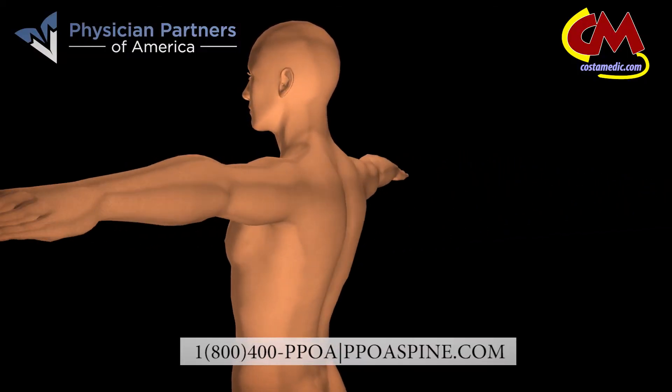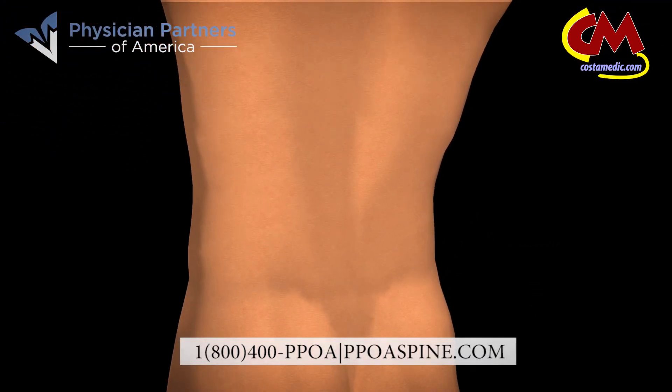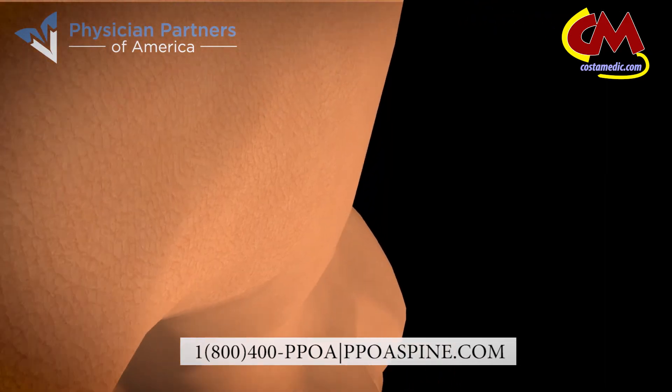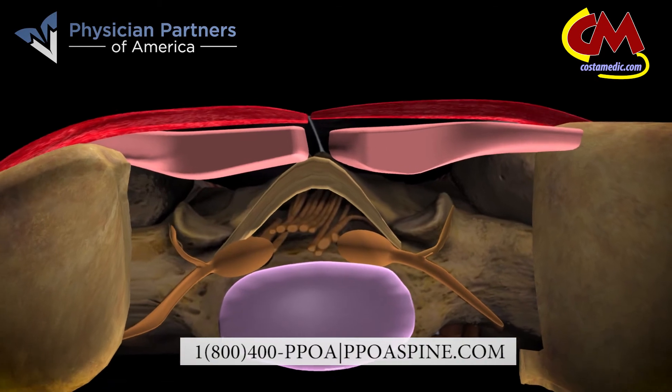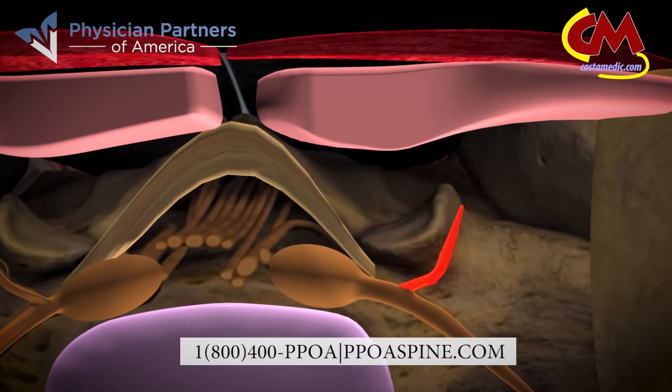This is a laser spine procedure of the facet joint for relief of back, neck, and leg pain. A small 2-3 mm incision is placed over the facet using fluoroscopic imaging to guide us. A guide pin is then placed under x-ray imaging onto the facet joint where the nerve that innervates the facet is located. A small tube is placed over the pin. The pin is taken out, the laser is then inserted, and the nerve that innervates the facet is laser ablated.